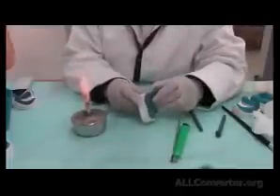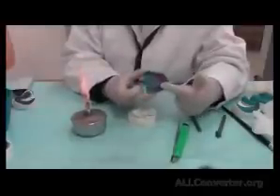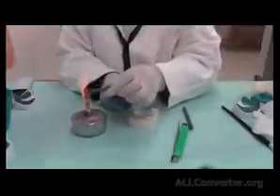So this is called border molding. I'm shaping the border of the tray using green stick material, taking an accurate record of the sulcus depth and width at function, not at rest. So that's why we need to do the border molding step. So I'm now ready to do the second section.